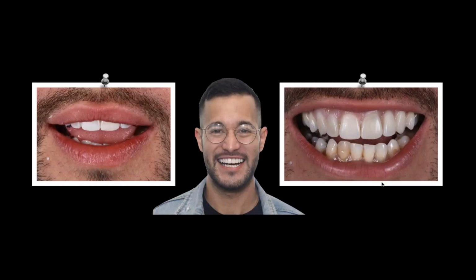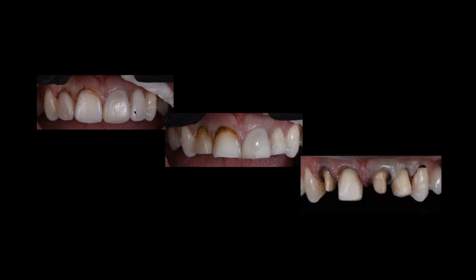Okay, so we're going to do some crown lengthening on this patient from the 7 and 8 area, and we're going to start to reprovisionalize. So you can see some of the crown work was done here, very nicely done. I'm not sure if one of my doctors did this or if it was actually done by a periodontist. It might have been done by Dr. Stuart Fromm, if I'm not mistaken. But in the end, you're going to see that some of the teeth were already full coverage preps and fairly dark shading, where the other ones were minimally invasive.